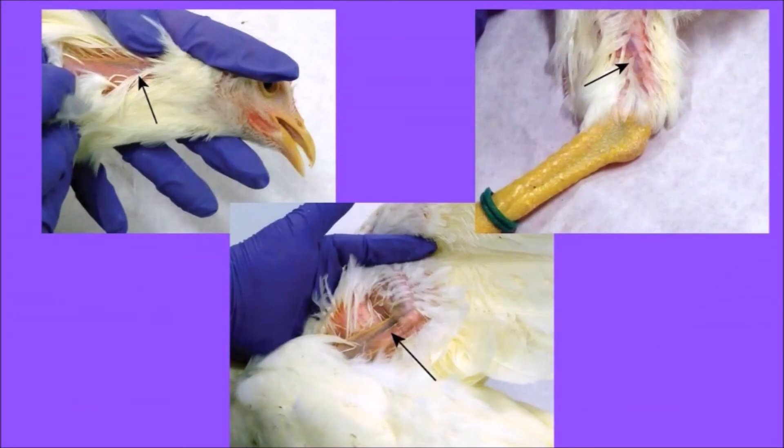Blood samples are taken for a variety of diagnostic purposes in chickens. In birds, blood samples can be drawn most easily from one of three vessels: the jugular vein, the brachial vein, or a medial metatarsal vein.